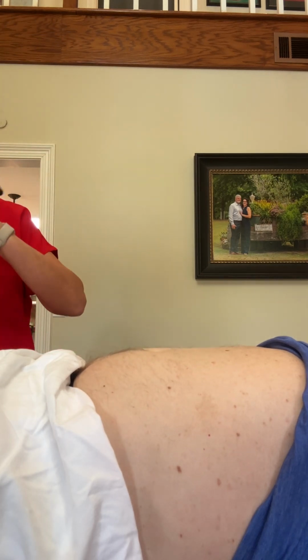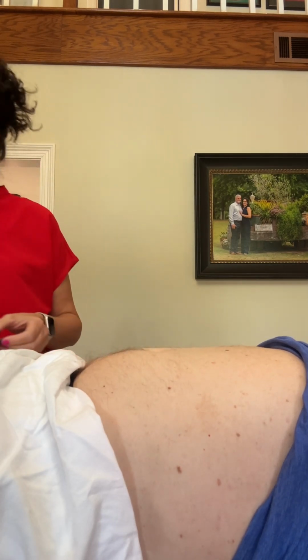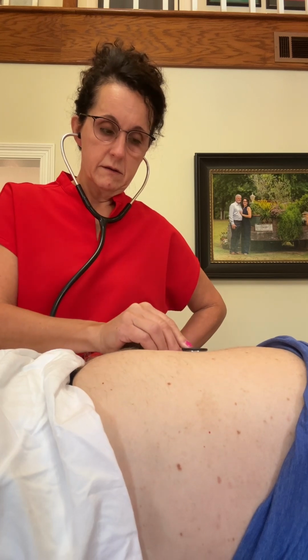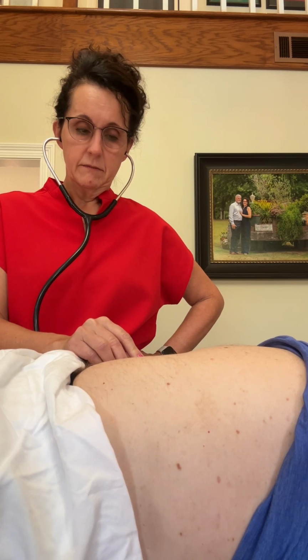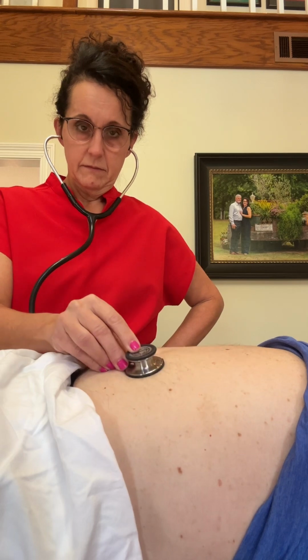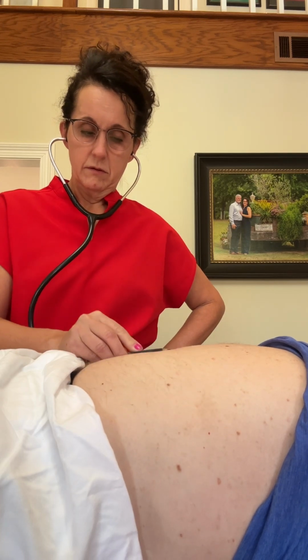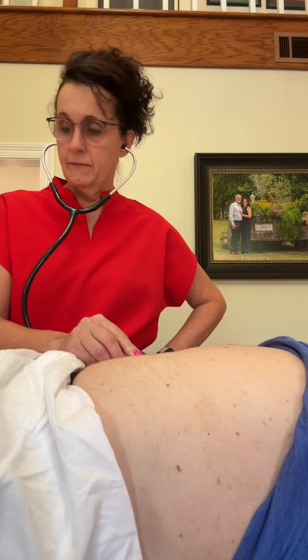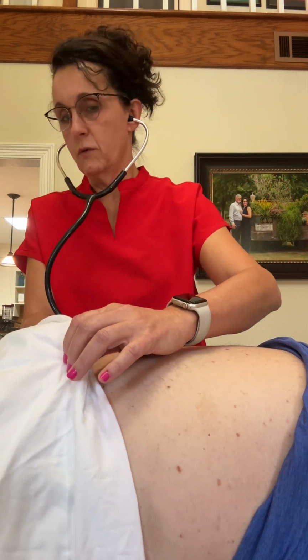So we will also listen to the renal arteries, the iliac arteries, and the femoral arteries. The renal arteries are on both sides of the aorta, above the umbilicus. The iliac arteries are just slightly below the umbilicus. So they should be using the bell. And then the femoral arteries on both sides of the groin. Okay.